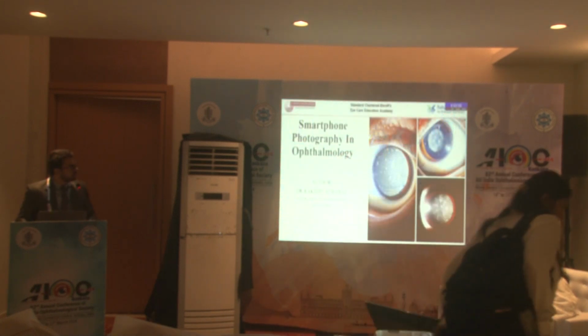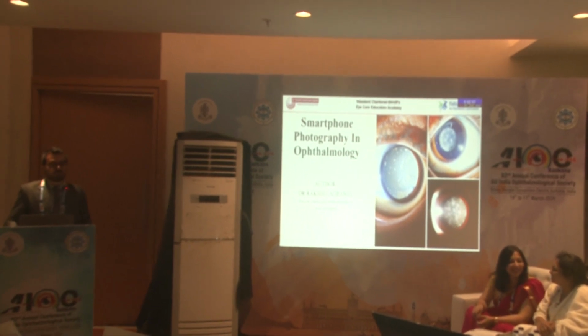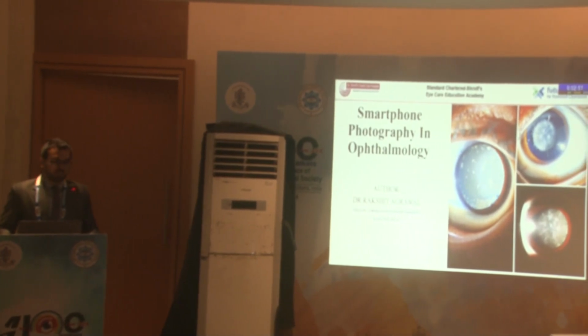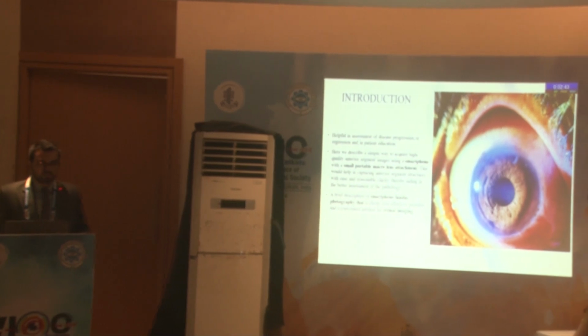Good morning, everyone. Today I am going to present my e-poster on smartphone photography in ophthalmology. In today's time, we all need to showcase our work, be it the post-op pictures, the pre-op, or any rare cases we see in the OPD. So, smartphone can be helpful in assessment of disease progression, regression, or also in patient education.